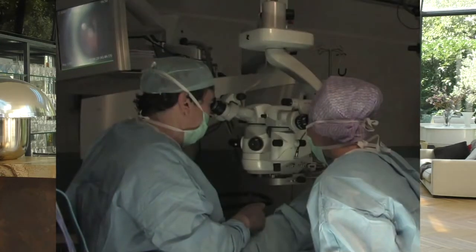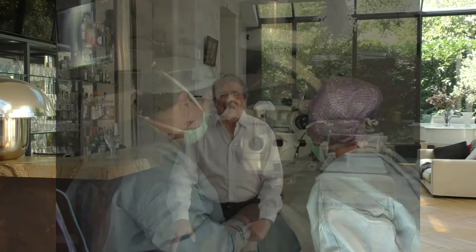The disadvantage of the external lamp is its bulk. It sometimes touches the sterile sheet covering a large patient and in practice it is often removed by the non-retinologist, which is a source of wear and disruption. This is why lamps integrated in the body of the microscope were designed. There are two of them: the Zeiss lamp and the top cone lamp called OFFISS, which is not ideal because it is placed frontally. A vertical slit gives the notion of relief because the angle between the slit and your left and right eye differs — if the slit is horizontal, the angle is practically the same.